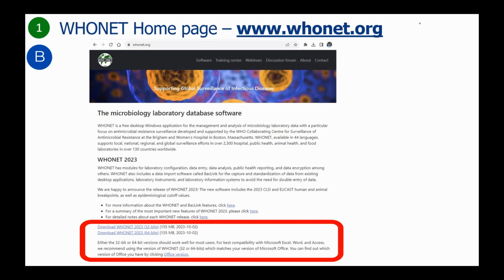About. This link provides some background about WHONET and a brief video. And finally, Contact. You can find the contact details for the WHONET team, and you can also join the WHONET mailing list. Here on this home page, you will see two links at the bottom that you can use to download WHONET. We'll take a closer look at this section on the next slide.